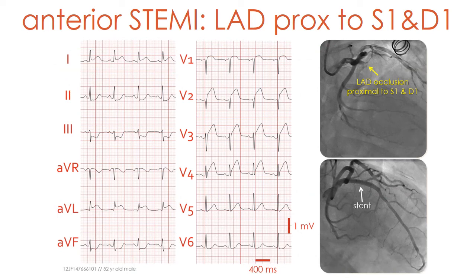This is another example of a STEMI due to an acute total occlusion of the LAD proximal to both the first septal and the first diagonal branches. The electrocardiogram shows ST segment elevation in leads V1 to V4 and also in leads AVR and AVL. The ST segment is depressed in leads 2, 3, and AVF, but also in lead V6. The coronary arteriography demonstrated that the left anterior descending coronary artery was occluded proximal to both the first septal and the first diagonal branch. Below we show the coronary arteriography after stenting the occlusion.